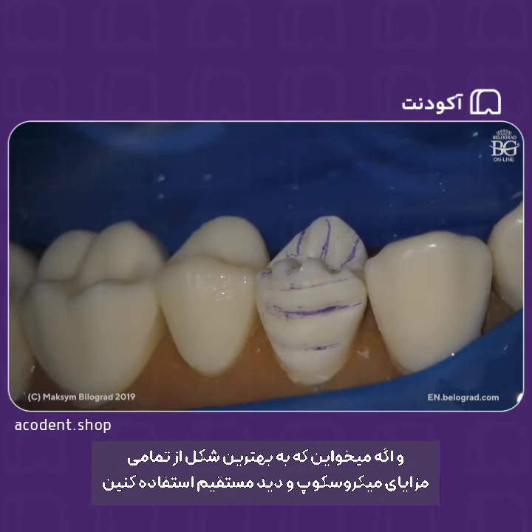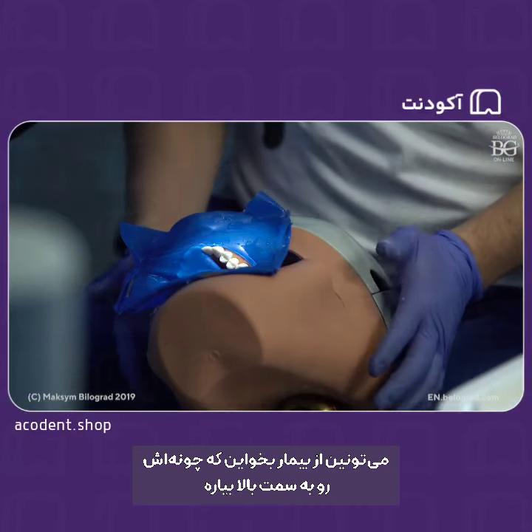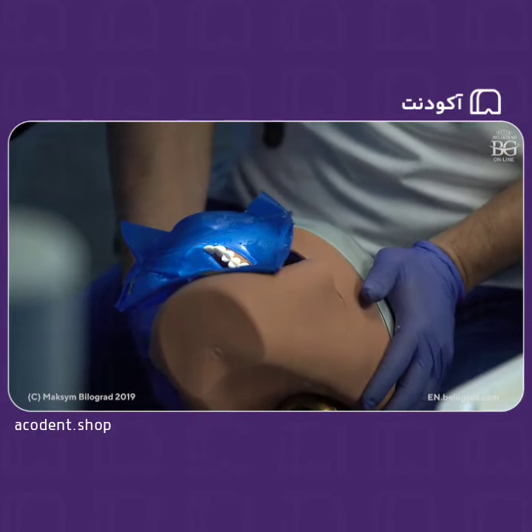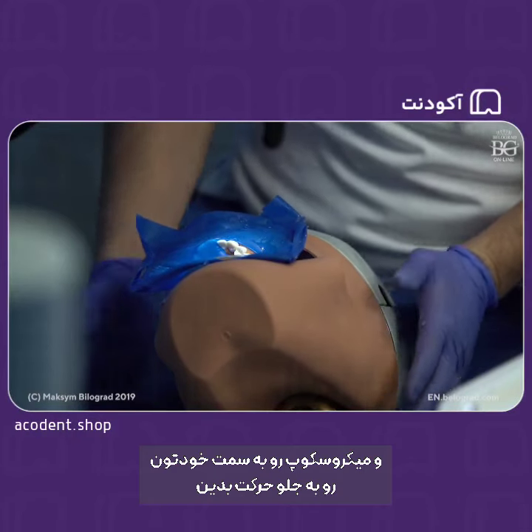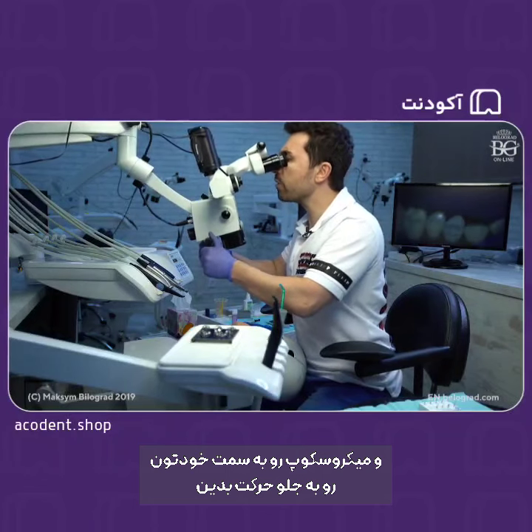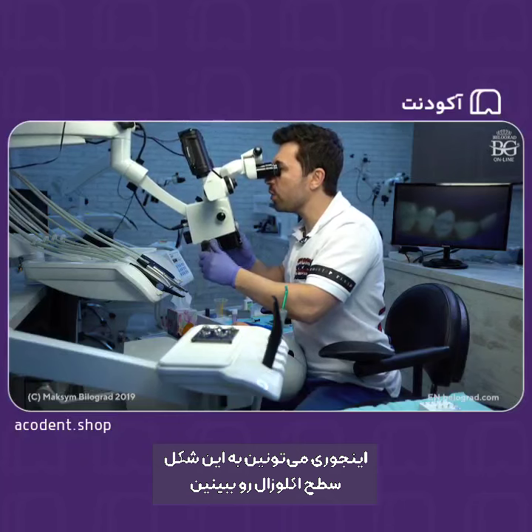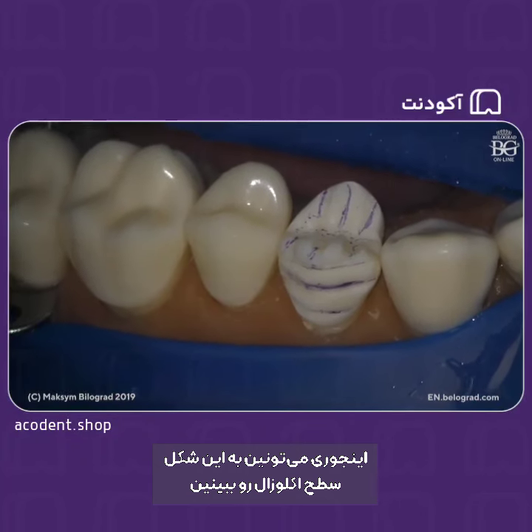And if you want to get all the benefits or all the possibilities of working with a microscope, with direct vision, you can now ask your patient to move the chin up. Okay, chin up. You move your microscope forward and tilt your microscope towards yourself, so you will be able to see the occlusal surface this way.